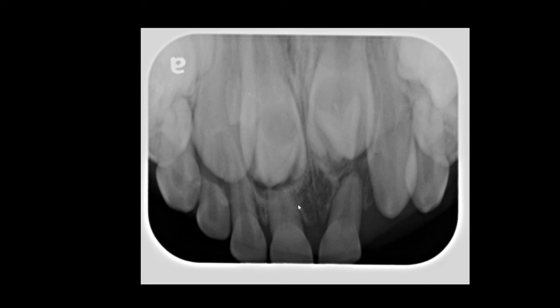Now let's look superior to the roots of the primary central incisors — there we find permanent central incisors 8 and 9. And just lateral to that we have permanent lateral incisors, so this would be 7 and that is 10. But if you look carefully at the crowns of the central incisors, what do you think is going on? You see the overall outline of the crowns, and then there's another crown-looking, developing tooth going on. Would you consider dens in dente, or what's going on? These are two supernumerary teeth that are located in the same area.